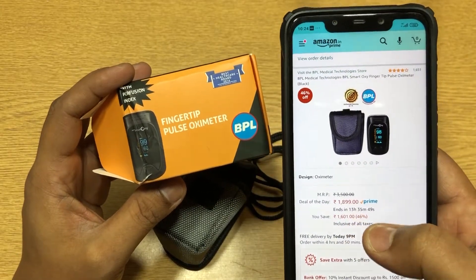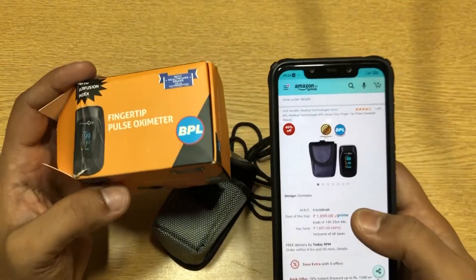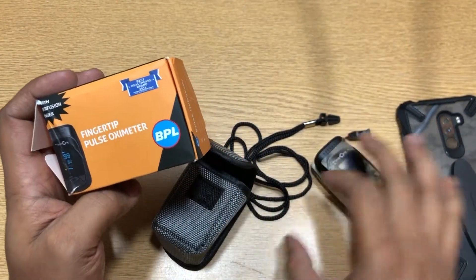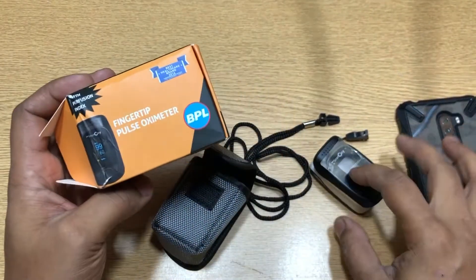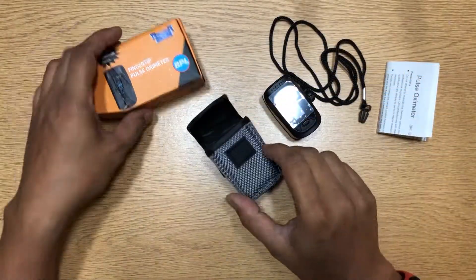So why should you buy this? What's the purpose of a pulse oximeter? We'll be talking about that, we'll be seeing how it actually works, we'll be taking a closer look at it, and we'll be talking about what other options are available if you don't have a pulse oximeter — how you can actually check your oxygen level.